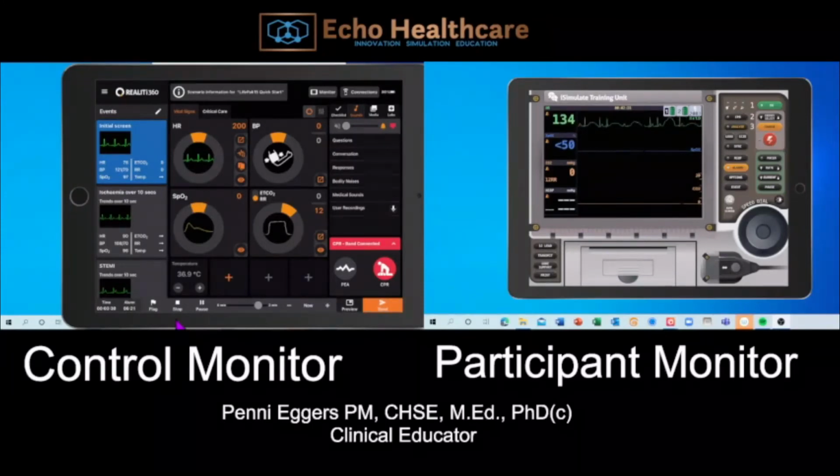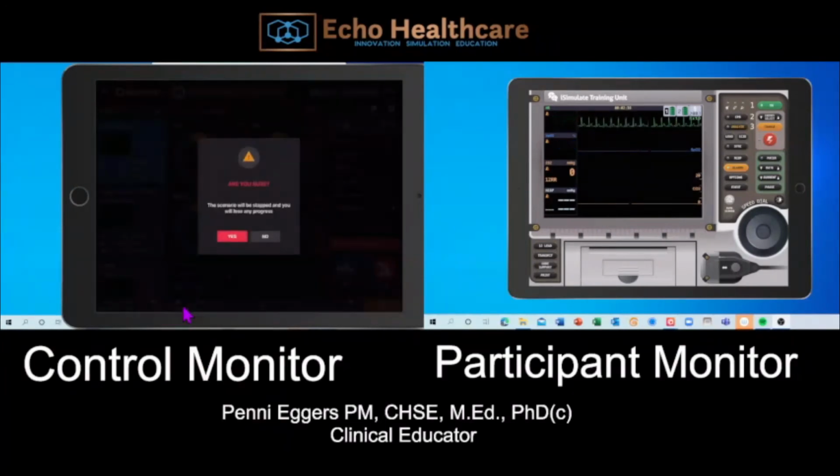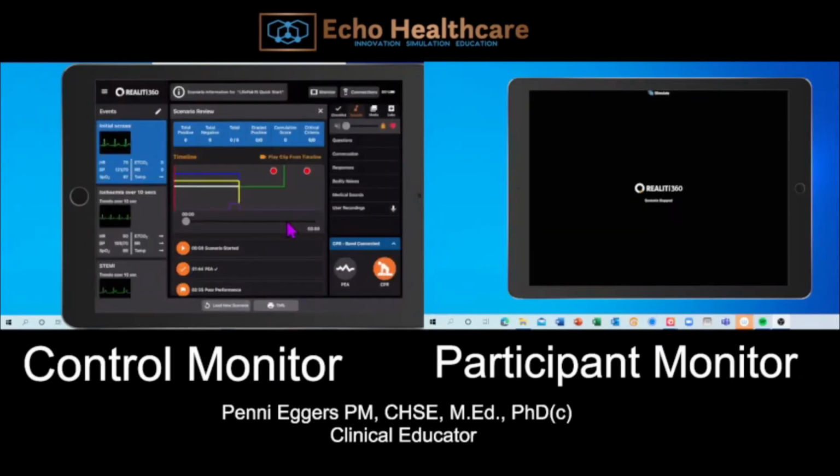All right, so we want to end this scenario. We want to see how I did. I can tell you I didn't do very well because I'm trying to do the monitor and do CPR on my leg, but let me show you how the analytics work. So I'm going to hit stop, which is right down here. I'm going to hit stop, and it's going to come up with the screen saying, are you sure? So I'm going to say yes. Now it's going to bring you to this real quick snapshot of what happened during the scenario. And this is a really good tool, especially if you have the iSimulate Pro, which you're doing video playback.